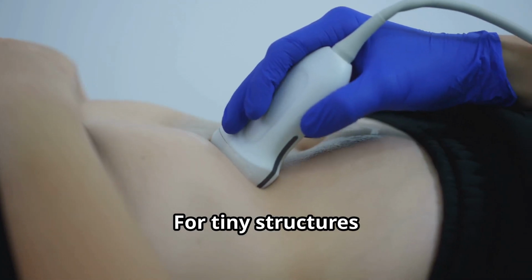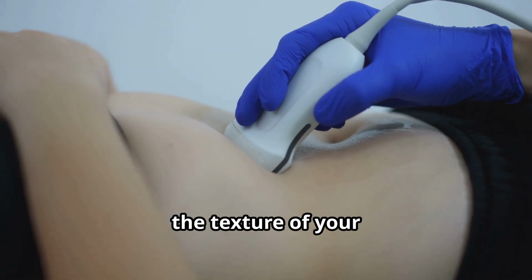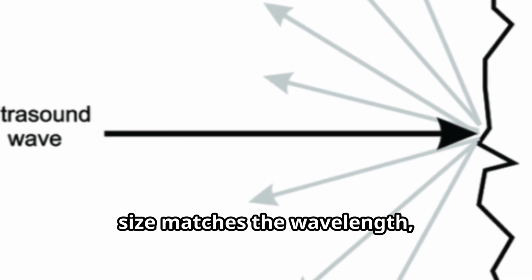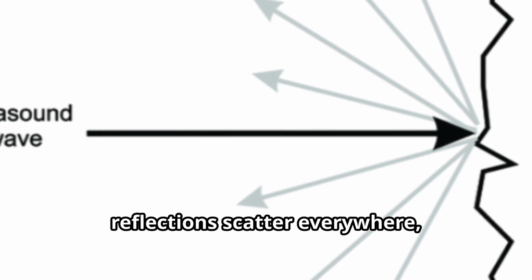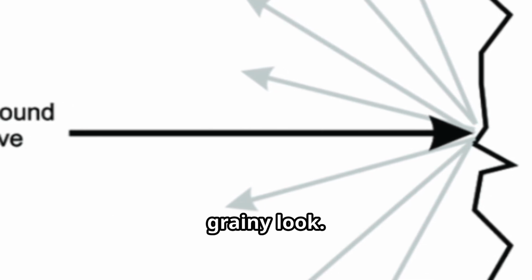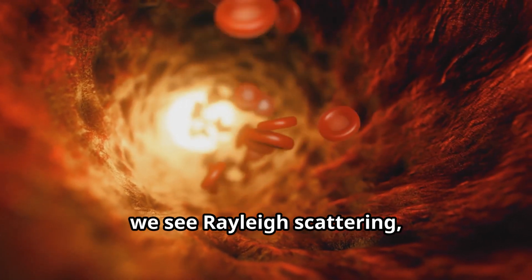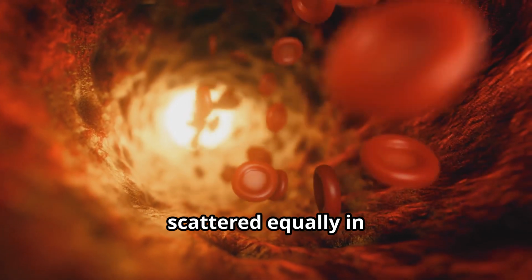For tiny structures, the texture of your liver, the texture of your pancreas, we get scattering. When the tissue's size matches the wavelength, reflections scatter everywhere, creating that soft, grainy look. If the structure is even smaller, like a red blood cell, we see Rayleigh scattering, where sound is scattered equally in every direction. Now, refraction.